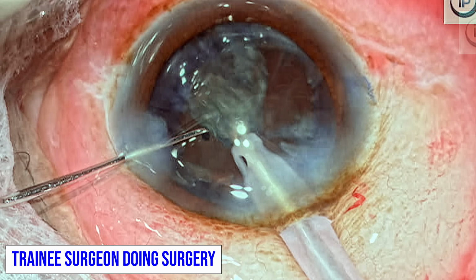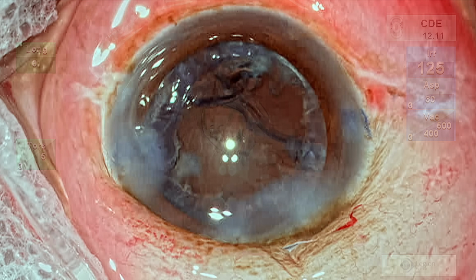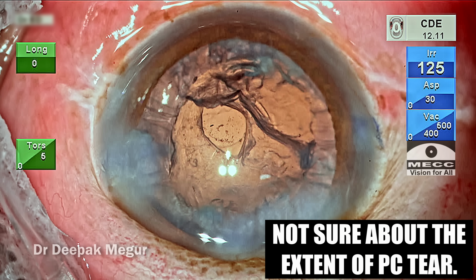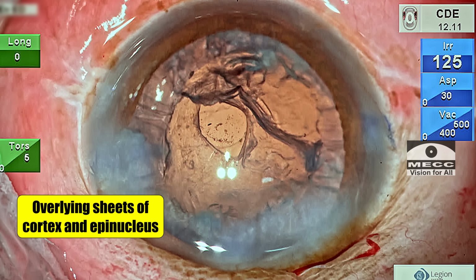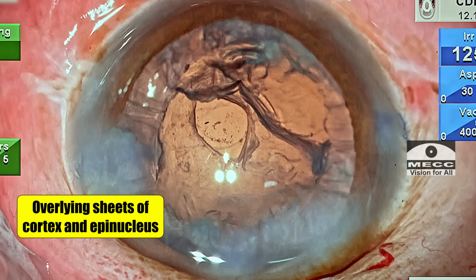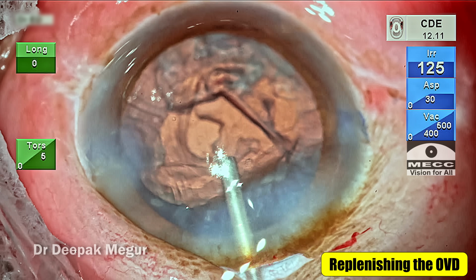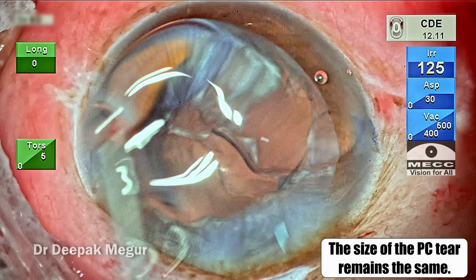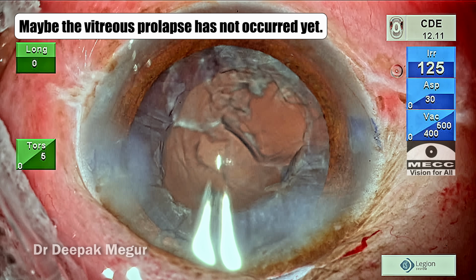A young trainee surgeon is operating, and after the last piece of emulsification, he's suspecting a posterior capsule tear, looking at this red hole-like thing in the posterior capsule. At this stage, he's not sure about the extent of the tear. He's just suspicious of it, simply because there is an overlying sheet of thick cortex and probably an epinucleus. The only thing convincing him is that when he puts in the OVD, the size of the circular tear doesn't seem to enlarge, suggesting that maybe the vitreous prolapse has not yet occurred.